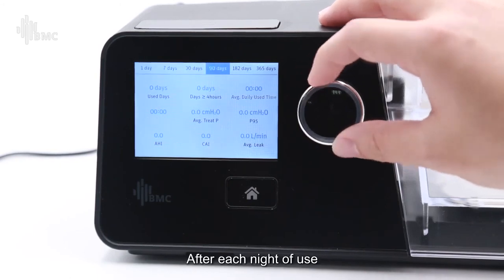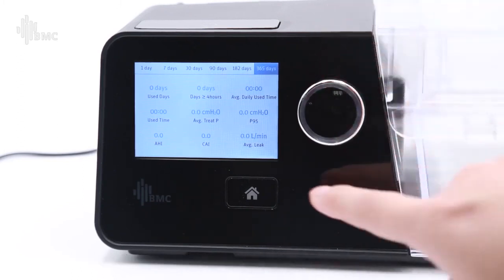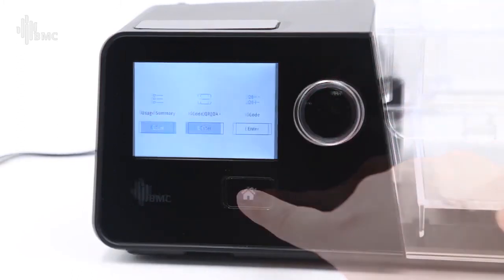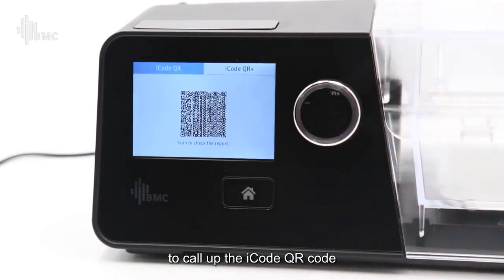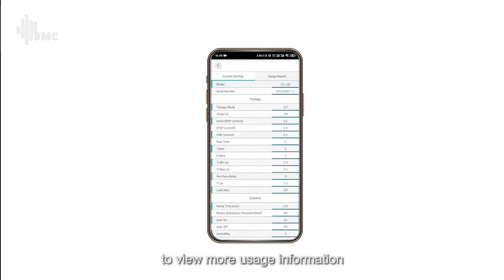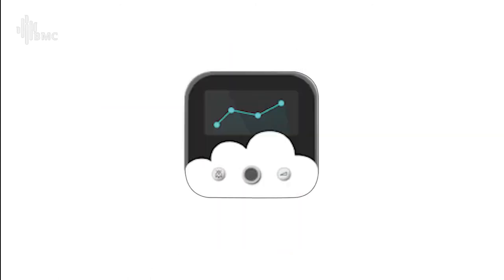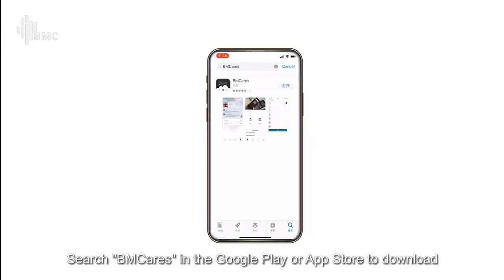After each night of use, a usage summary of last night's data will show on the screen. Rotate the knob to move the cursor to the right side to call up the iCode QR code and scan the QR code using the BMC Cares app to view more usage information. The BMC Cares app. Search BMC Cares in the Google Play or App Store to download.